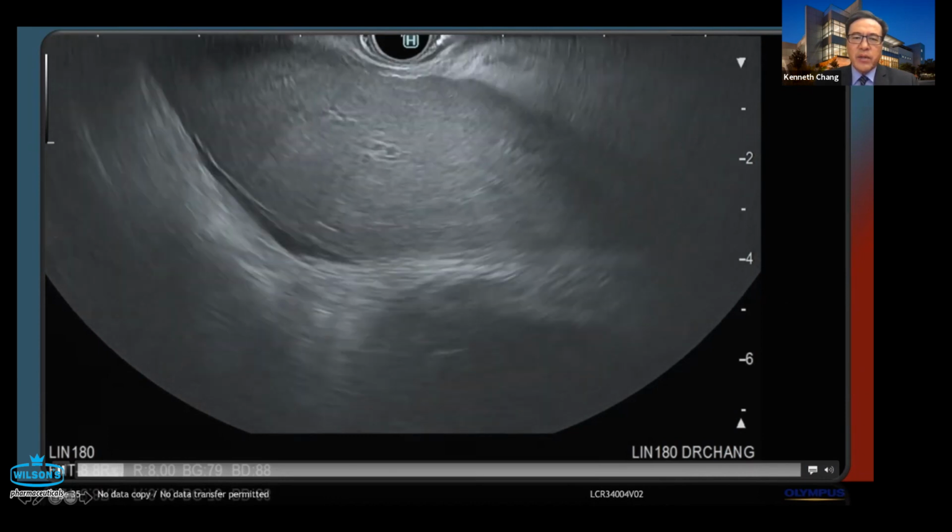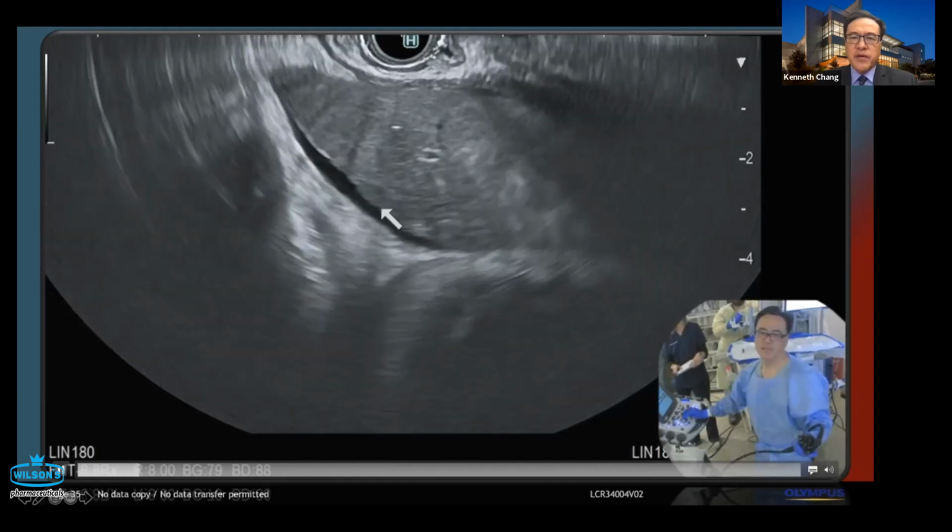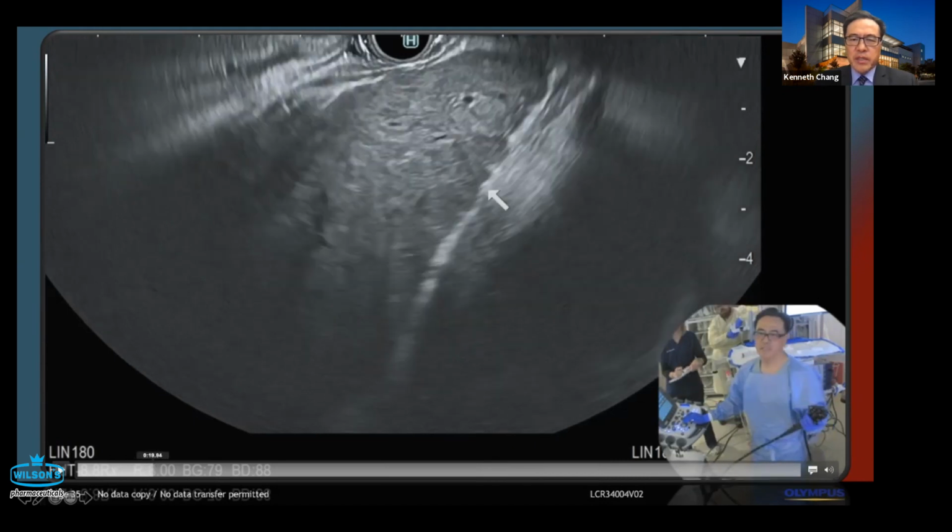So already we're suspecting cirrhosis, right? It doesn't indent, it just moves away. Our palpation is very stiff. I tried to palpate and the liver moved away. And again, the liver surface is more nodular. So that was a quick endohepatology assessment. There's a regenerating nodule in the liver.